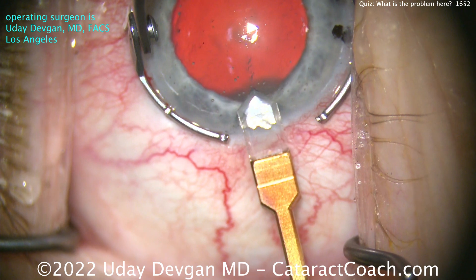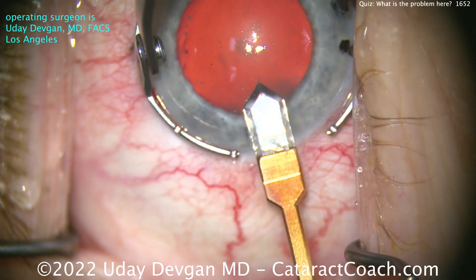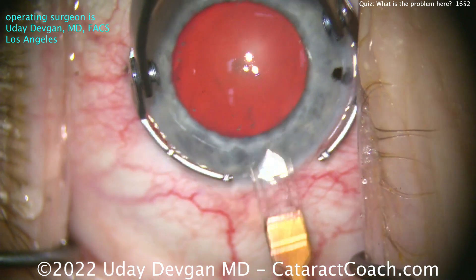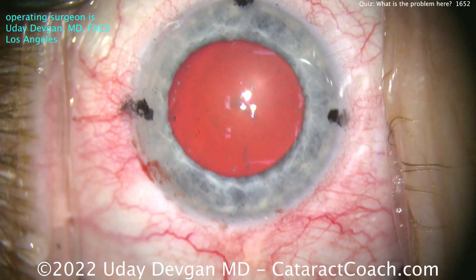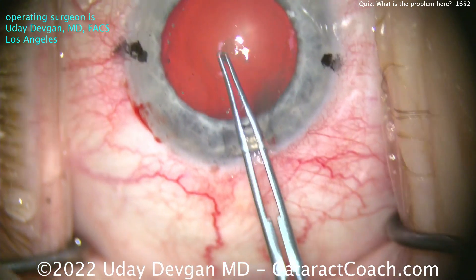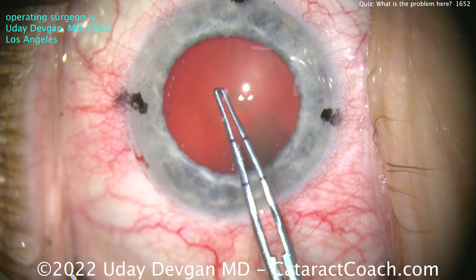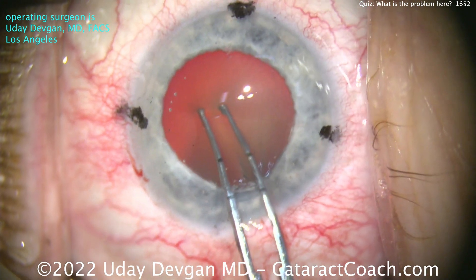Let me show you — there's the incision, looks pretty good using a diamond keratome. You can see we're operating on the steep axis; the little marks on the cornea show me the steep axis, so we're going to do a toric lens here. I want to show you the beginning of this case — it's a beautifully normal capsulorhexis. This is me operating; I've done tens of thousands of cases.